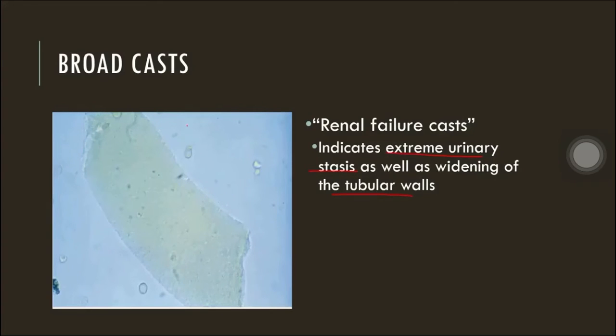So this is an example of broad waxy cast. Okay, broad waxy cast yan. Next, we now move on to crystals.